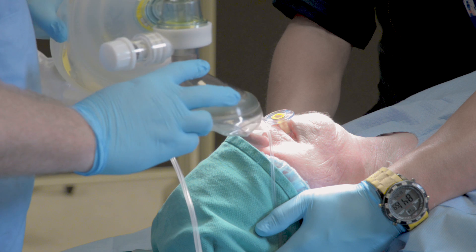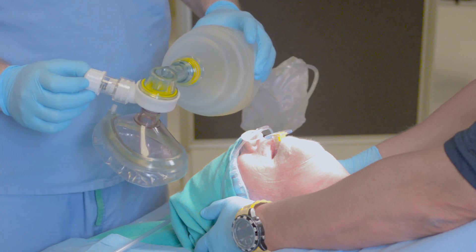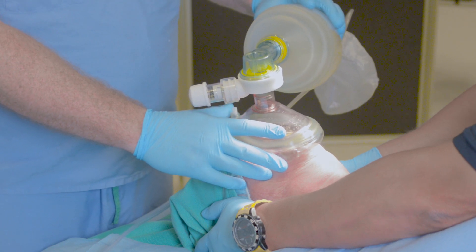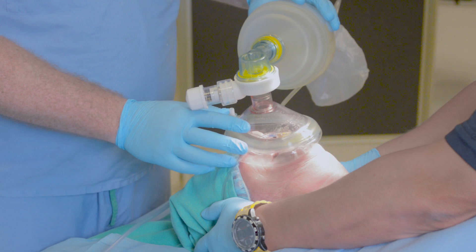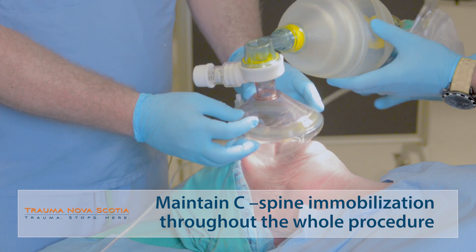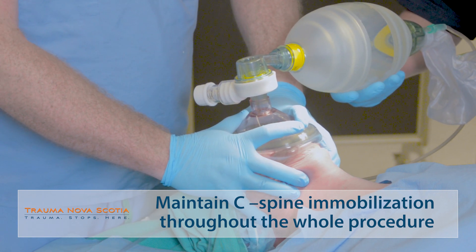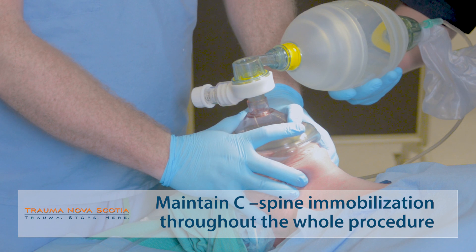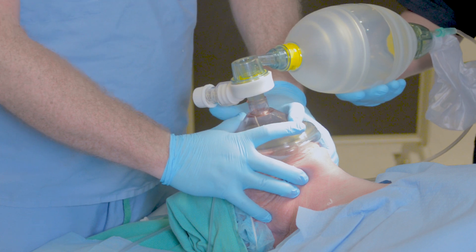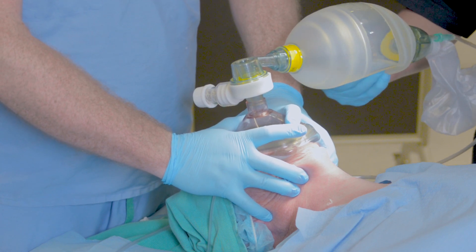We have two sources of oxygen for all sick patients, and two devices for obstruction — the first for soft tissue, the second alveolar, dealt with using a disposable PEEP valve. The next two is two hands on the patient's face to ensure a seal. The primary operator holds the mask onto the patient's face with two hands. If we're unable to ensure a seal, the high-flow nasal prongs are ineffective and the PEEP valve delivers no positive pressure. The expertise in this entire procedure lies with the practitioner holding the face mask and ensuring the seal.